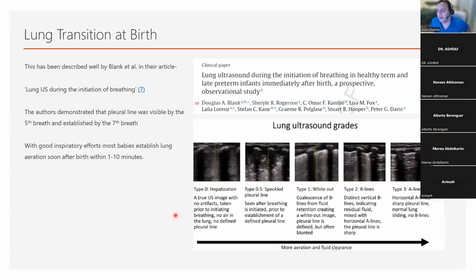Okay, now I'm going to end this bit of the presentation before we move into proper lung pathology by quickly talking about lung transition. As I've mentioned to you, and I will share Blank's article with you today, what is normal for a baby has to be dealt with based on the baby's clinical presentation, age of presentation, and symptoms.